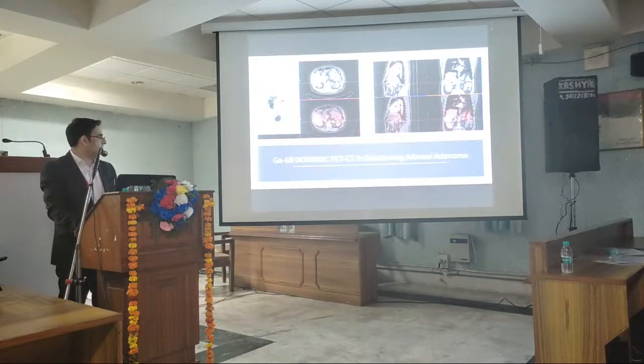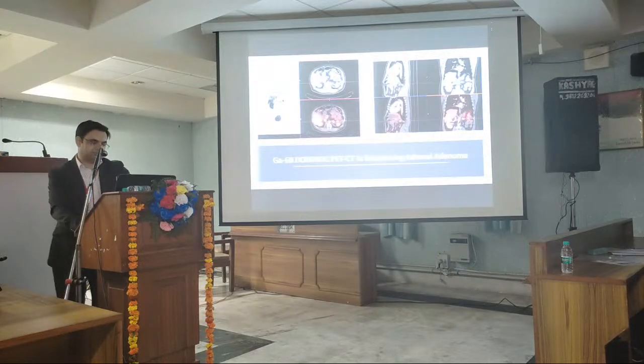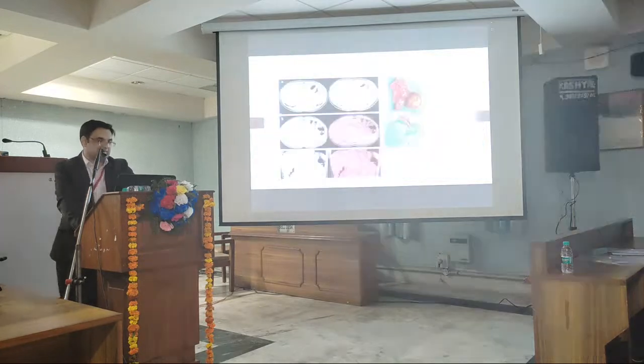Then gallium DOTATATE also helps in differentiating functioning versus non-functioning adrenal adenoma. This patient had accelerated hypertension, a 45-year-old male with adrenal hyperplasia, and we have to look for any abnormal focus of ectopic secretion. This is the abnormal focal uptake, and then the patient underwent surgery and adrenalectomy was done to relieve the hypertension.